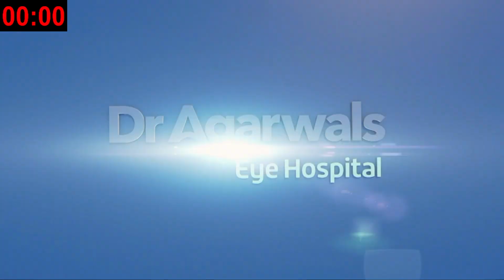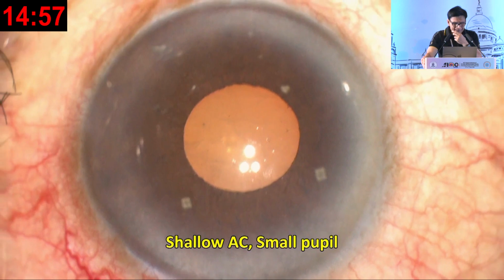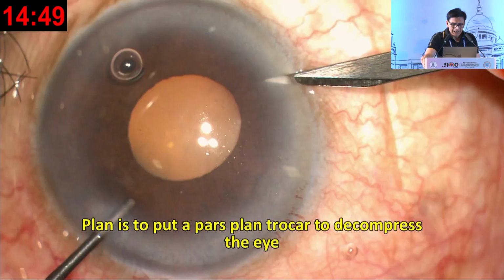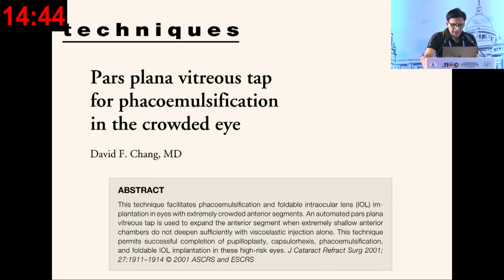So basically, I thought I'll show you some various scenarios. So let's see this first case. Now you see in the case here, there was a shallow AC with small pupil. Now whenever you have something like this, the chamber is very shallow. I'm injecting viscoelastic, making my incision, but still I'm struggling. So I thought now I wanted to decompress the eye.